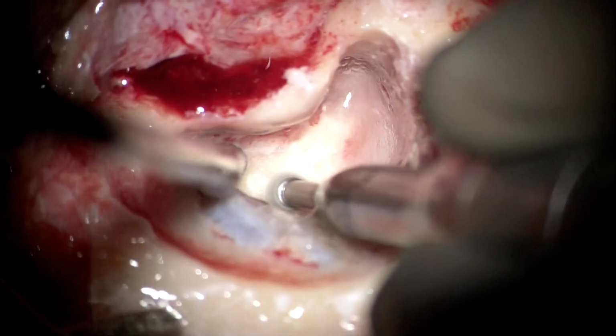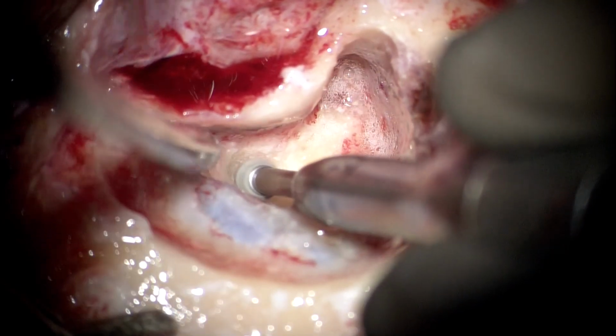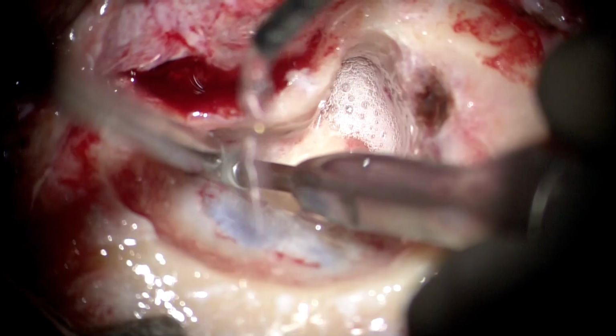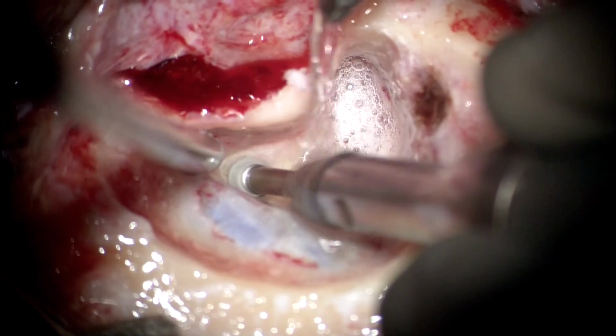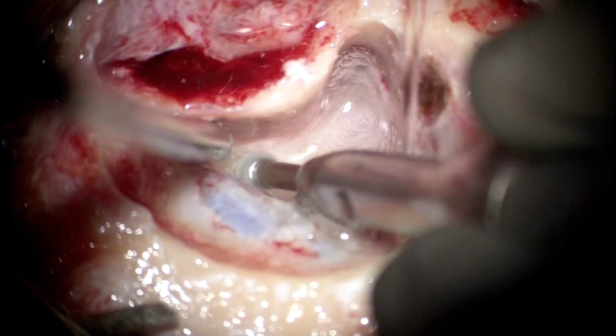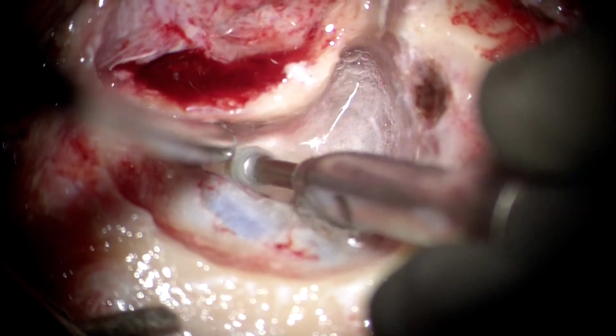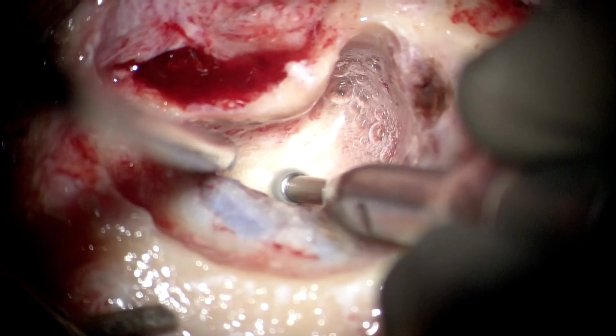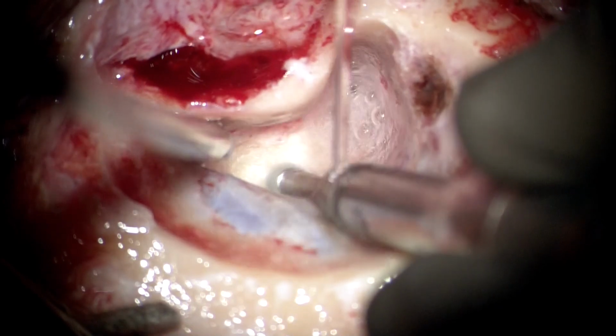The ampulla of the posterior canal is actually quite anterior towards the vertical segment of facial nerve. So one has to drill that area, but it has to be constantly borne in mind that since the vertical segment of facial nerve is lateral to the posterior ampulla, the facial nerve does represent a potential complication while doing this surgery, and that has to be always kept in mind.